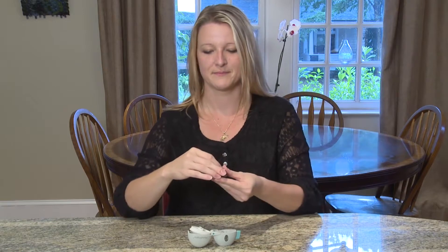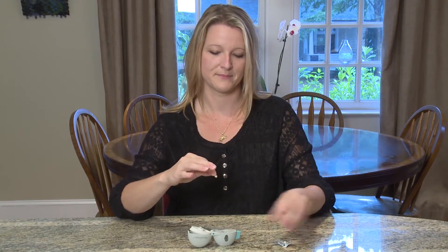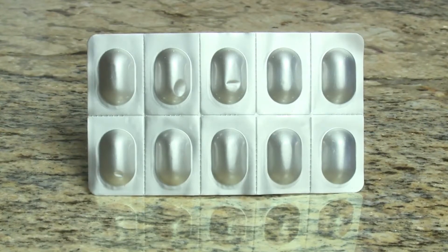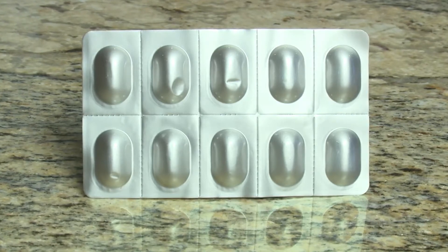Then open your medicine blister pack by peeling the foil from one capsule. Only take out one capsule from the blister pack. Do not open the other capsules because they react to light and water. Never swallow these capsules. They should only be used with your Handihaler.